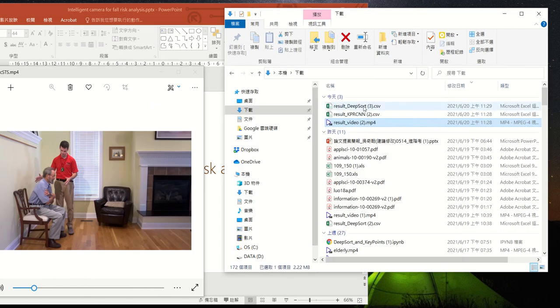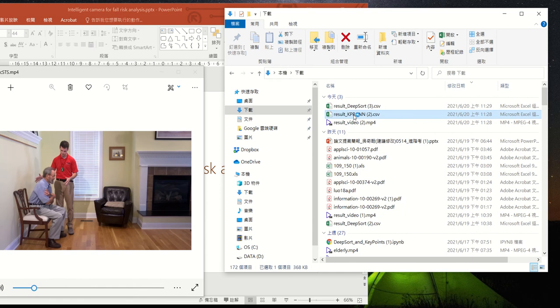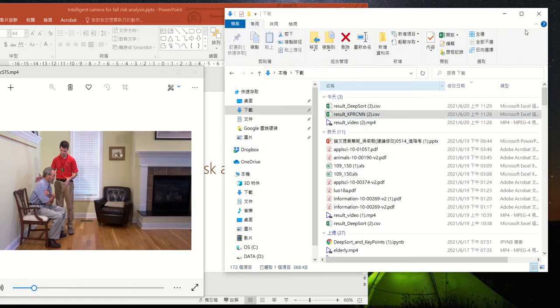And this is the data from DeepSort: the frame and ID number. And this is the data from the KeypointsRCNN to recognize the joints. This file is pretty large because it covers 30 seconds. It has the frame number, subject ID, and the 17 joints.